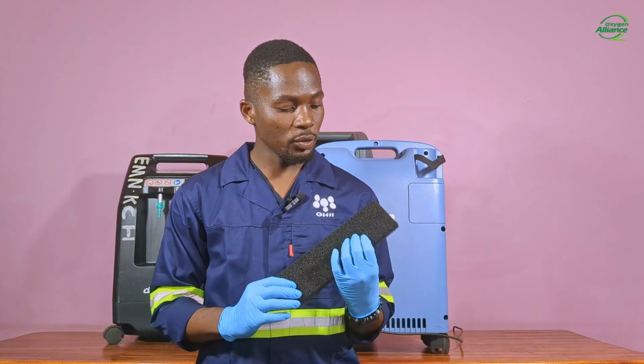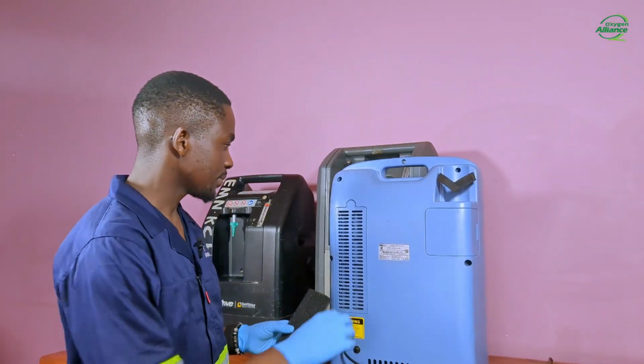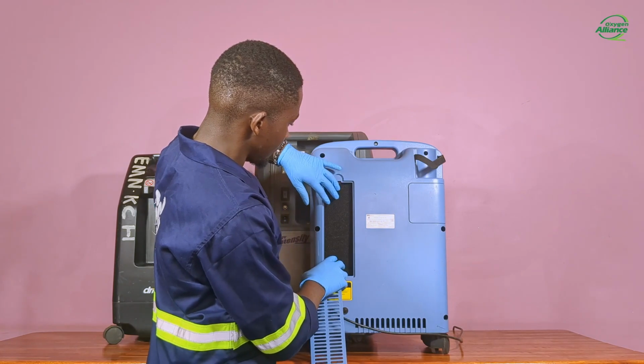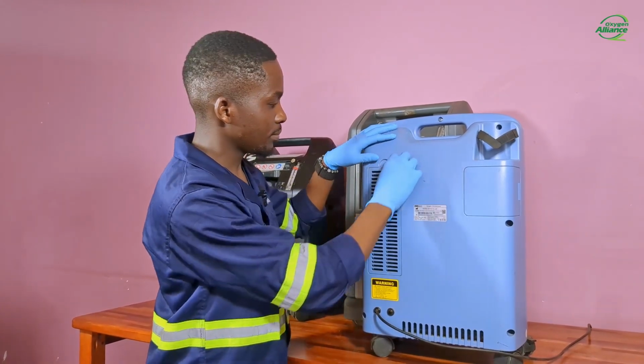So after washing the filter and air drying it, I'll now put it back into the machine. So that is how you can access and clean the air intake filter of an oxygen concentrator.